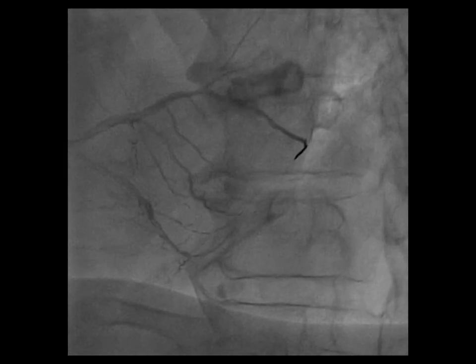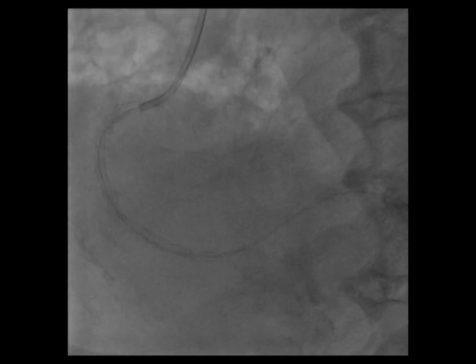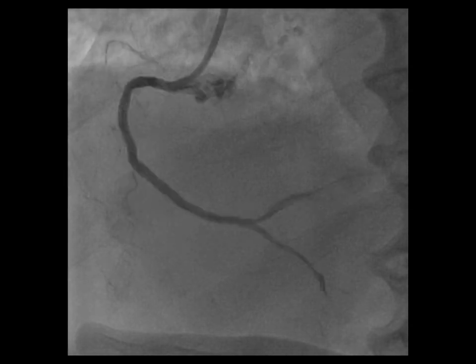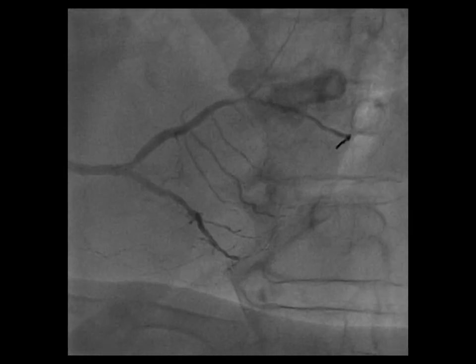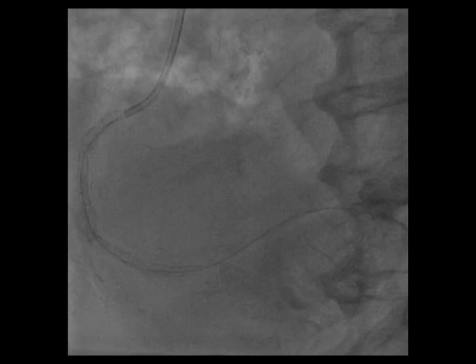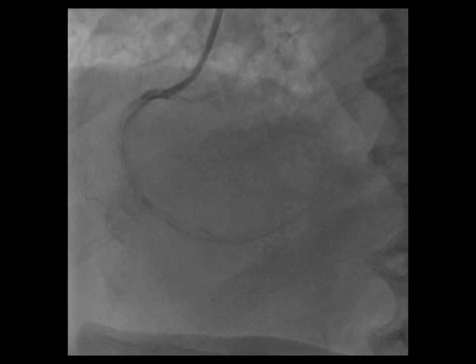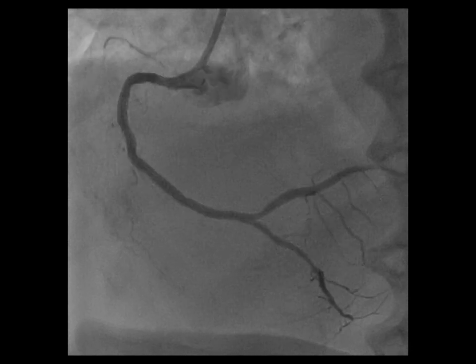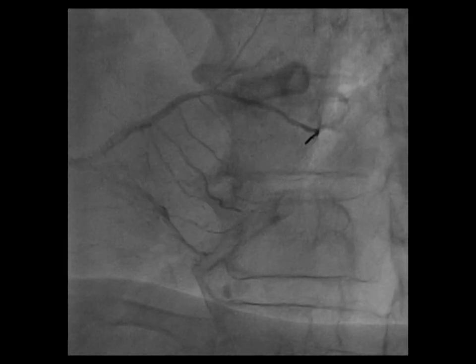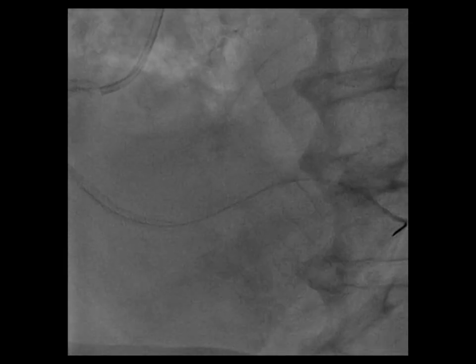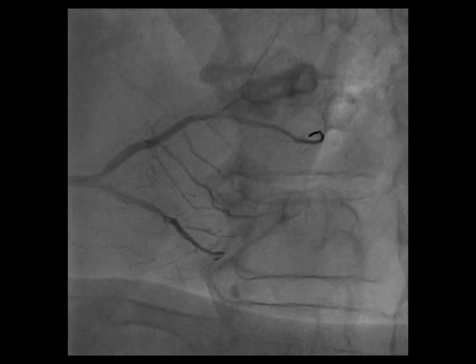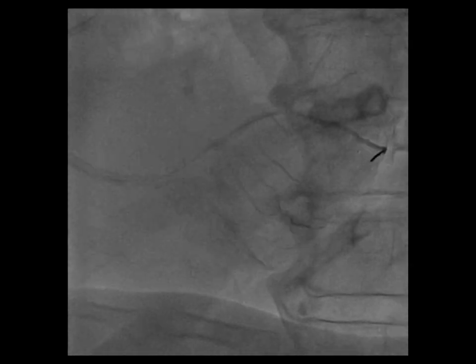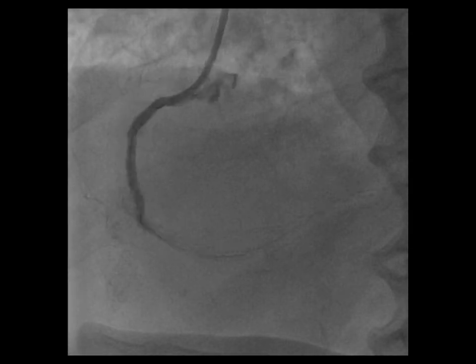After we treated the distal segment of the right coronary, we had to cover the entire proximal and mid-segments of the right coronary, so it ended up with a metal jacket spanning almost most of the right coronary artery. But you can see the optimal final result and TIMI-3 distal flow in the vessel.